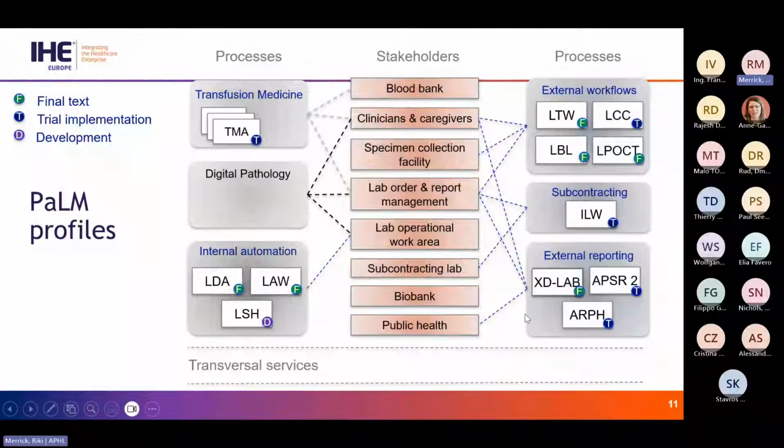And we'll be working on more. We have internal automation, specifically laboratory device automation in final text. And then we have laboratory analytical workflow. So that's the IVD test instrument to the laboratory analytic manager.